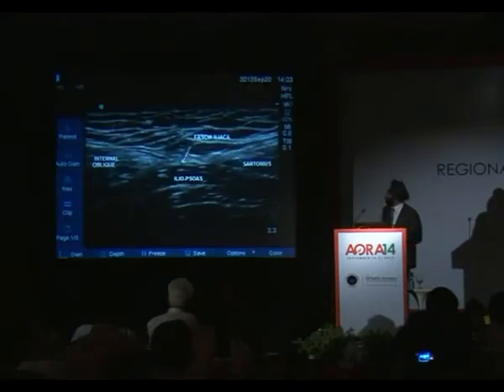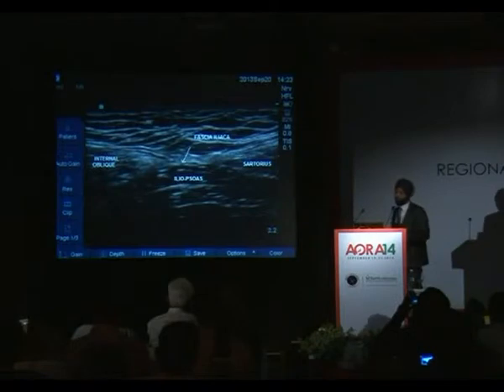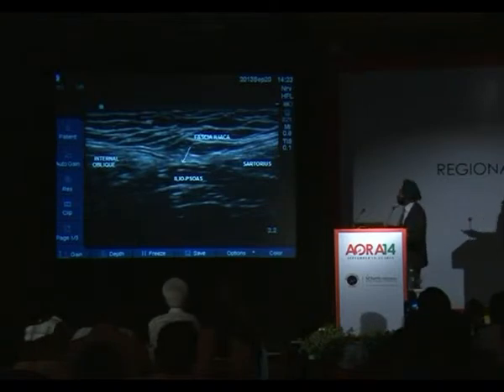So that's a paper we presented in Regional Anesthesia. All we need to do this block is recognize this pattern. As the previous speaker was just talking, we always have some surrogate markers. We always depend upon our arteries to find our nerves. But this block just has these three nerves. So that's caudal, that's cranial.